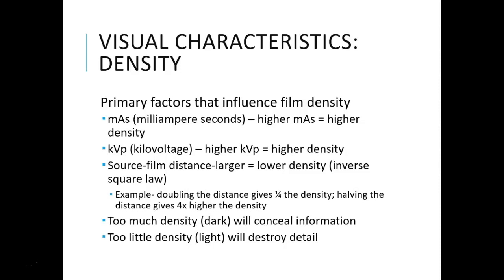Too much density is a dark film, and this will conceal information. Just think about turning out the lights. It's too dark, you can't see anything in the room. Too little density is really light, and this will destroy detail. Think of flooding a room so full of light that everything gets whitewashed. You can't see the detail. So it's too extreme in the opposite direction.